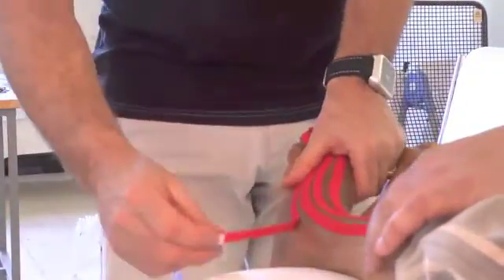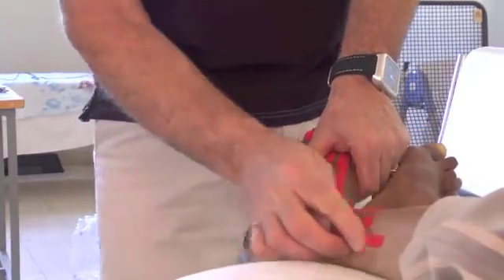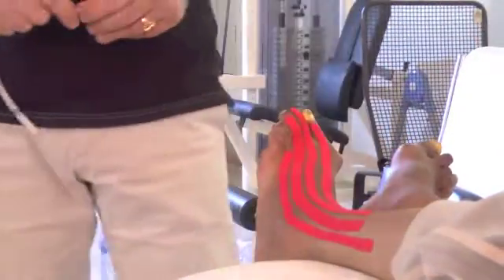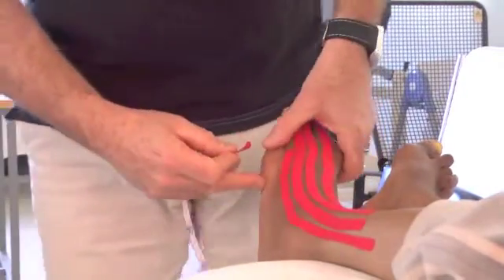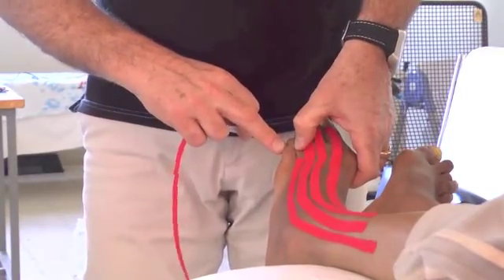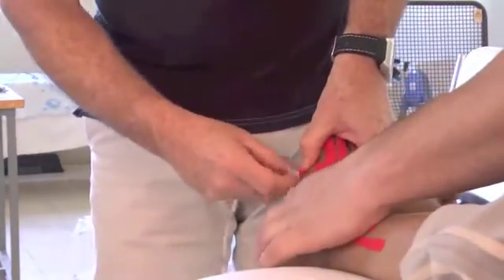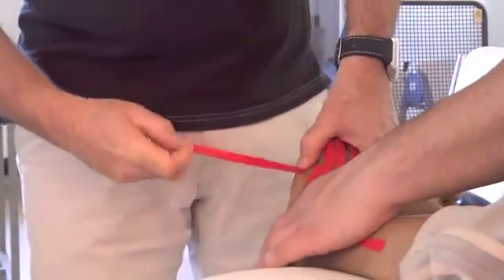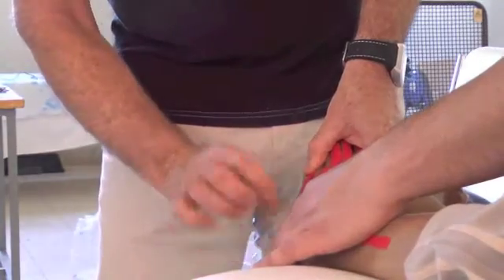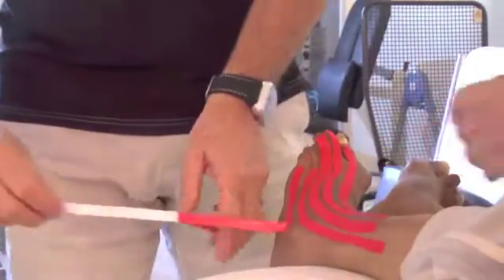Maintain the position and then we're going up, like that, and stick. So in this position, just stretch the skin, just like that. Here is the malleolus — we're going to go over the center of the malleolus, just like that, and stretch.